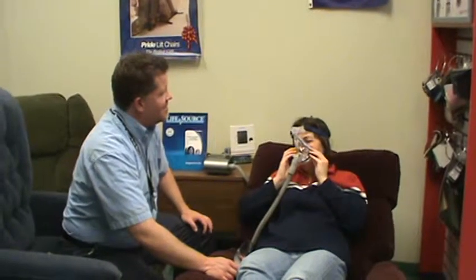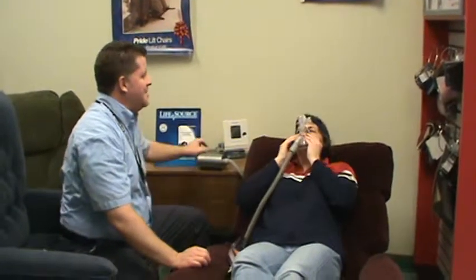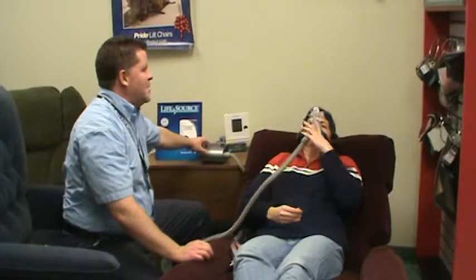There you go. Very good for the first time. Now we'll start pressure again.